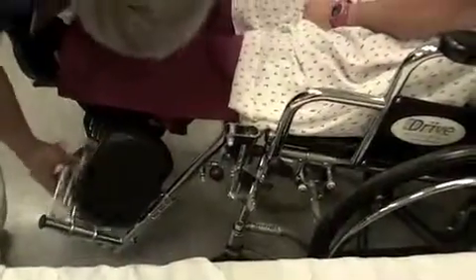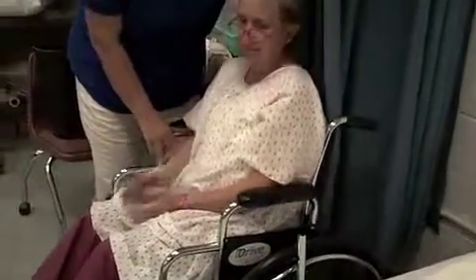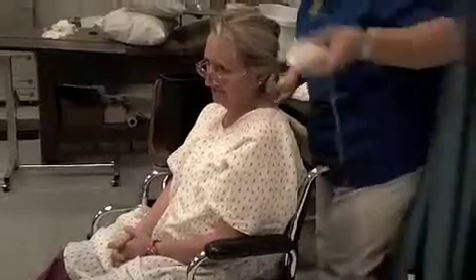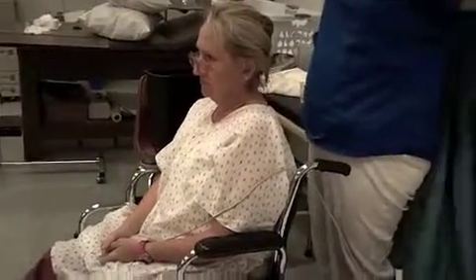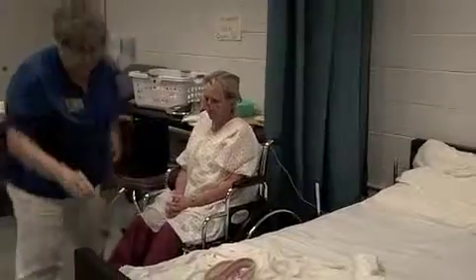Since I did the little flipping thing, I'm going to have to unlock her so I can get her leg back on there. They sure got to put it back on — they've got to put the foot on the footrest. Foot's on the footrest. I'm going to leave her in her room, so I'm going to take this gait belt off — that's part of one of the steps. I need to give her a call bell because she's going to stay in here. I would have pulled the curtain but I didn't so y'all could see. You're going to undo your privacy. You've got your call bell, your feet are on your footrest. I'm going to put my gait belt back on the table where I got it, and wash my hands. And I'm done with that skill.